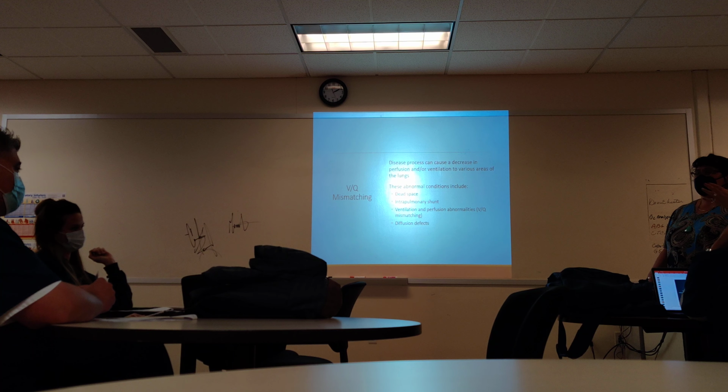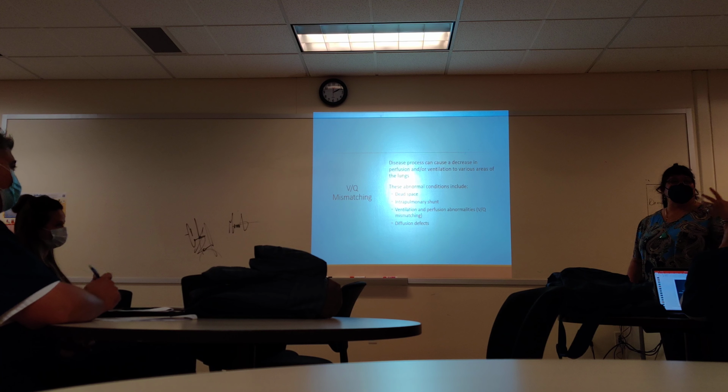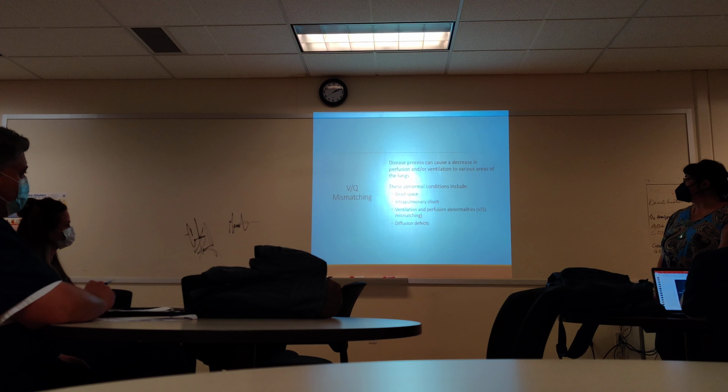Because, again, the ones at Kindred and AMG are not going to have all the fancy graphics and the advanced modes because it's just not required. Why would you spend $20,000 per ventilator on stuff you're not going to ever use? So that's kind of the key.